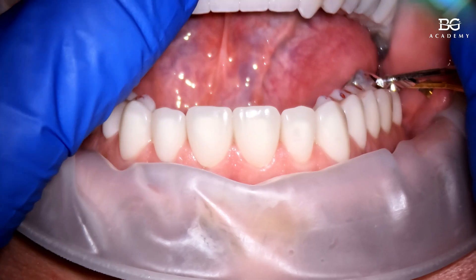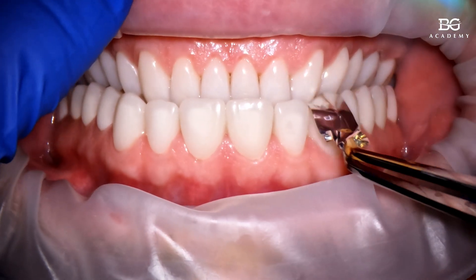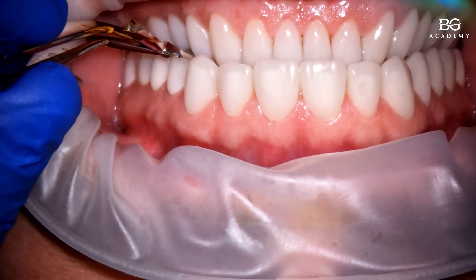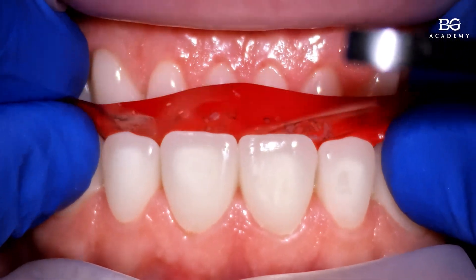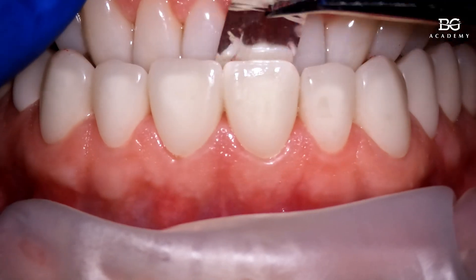Here is the video showing how I check the stability of the occlusion and contacts with the shimstock. The shimstock is a very thin foil, just 8 microns. You can see that on one central incisor it was sliding, but the other central incisor held it, confirming a so-called super contact on the front two teeth. We reconfirm it with the articulating paper, then make some equilibration. Now you can see the shimstock is sliding out very gently. This is a very small but very useful practical tip — have shimstock in your dental clinic to see how the patient holds this 8 micron foil in the back and front areas, and make any necessary adjustments straight away.